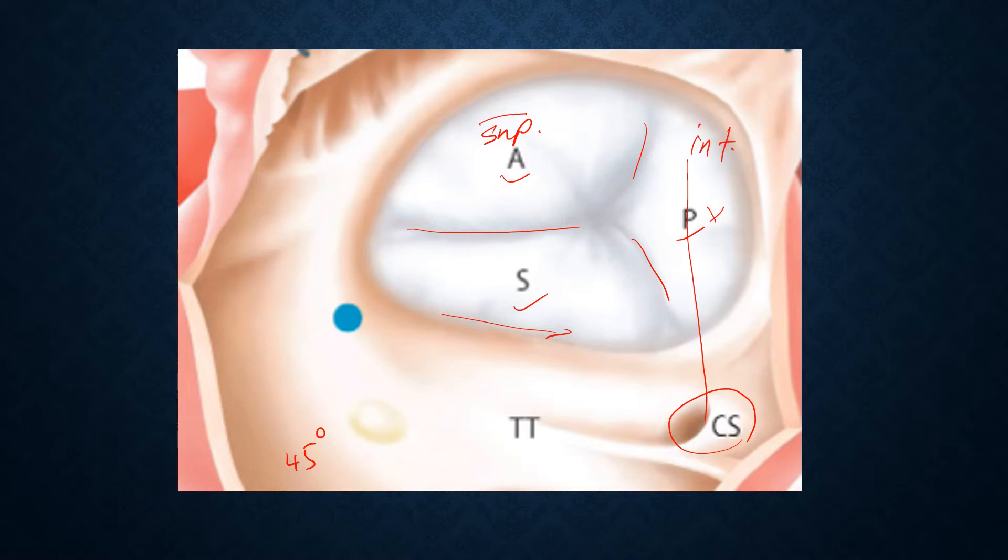The septal leaflet - this is the most superior part of the septal leaflet, and the most inferior part is next to the posterior leaflet.